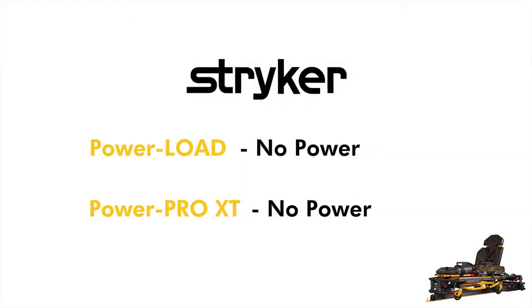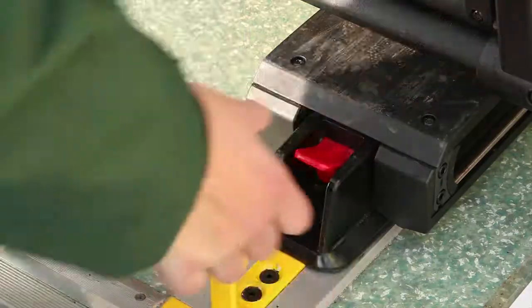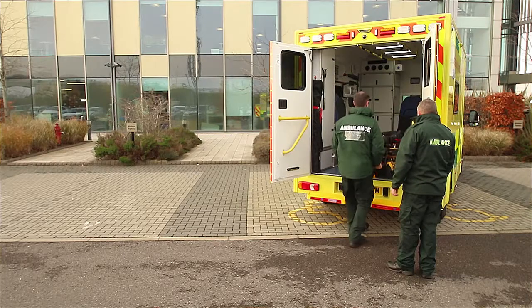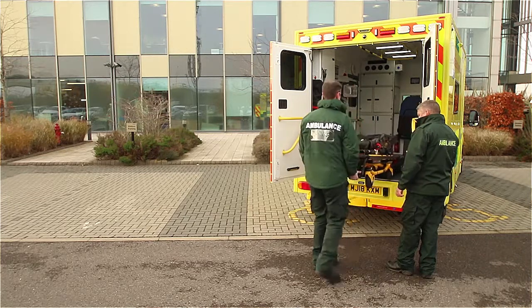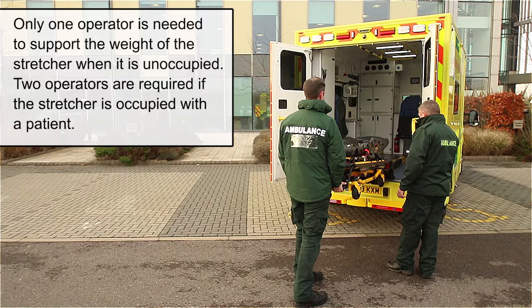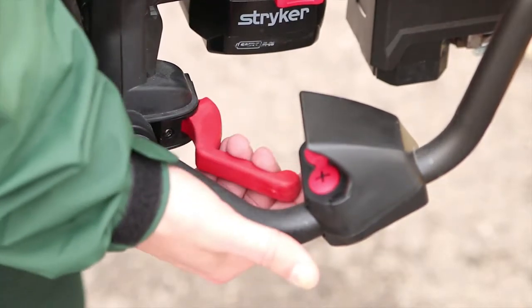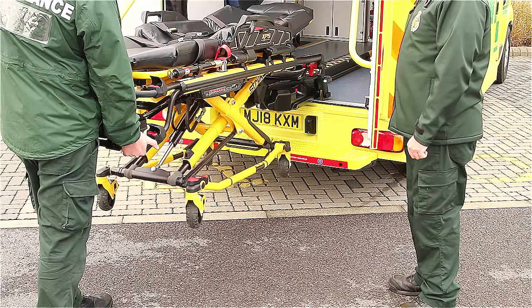In this scenario there is total power loss to both the stretcher and PowerLoad. To unload the stretcher, press and hold the red release lever at the foot-end of the PowerLoad. Guide the stretcher out until it comes to a complete stop while two operators support the stretcher at all times. Locate the red manual backup release lever on the stretcher; squeeze and hold it until the legs touch the ground.